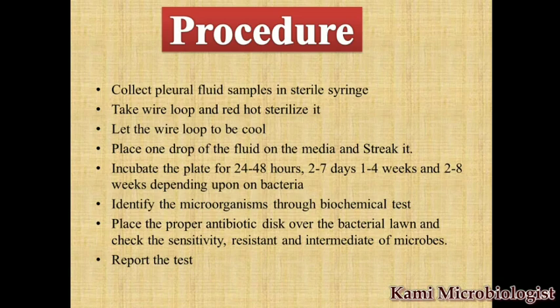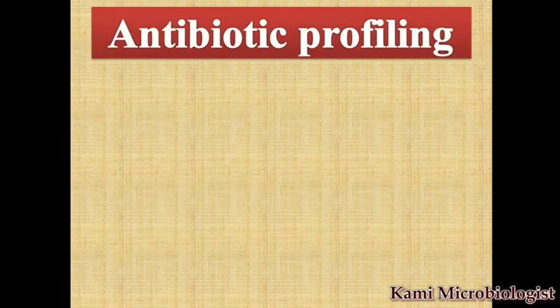If there is growth, then you will mention the growth of the bacteria. If there is no growth, then you will say no growth of any microbes obtained after 24 hour or 48 hour or 1 to 4 weeks incubation. This is how the reporting is done.